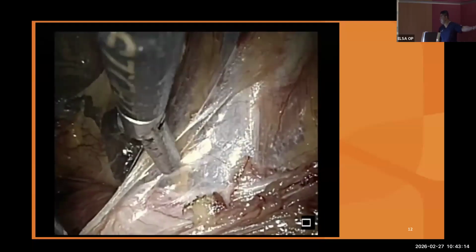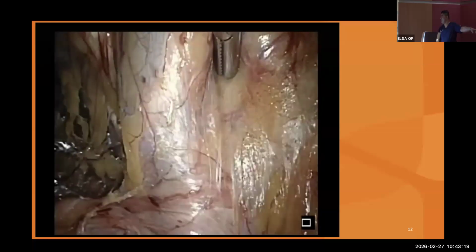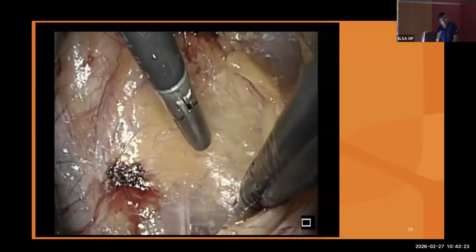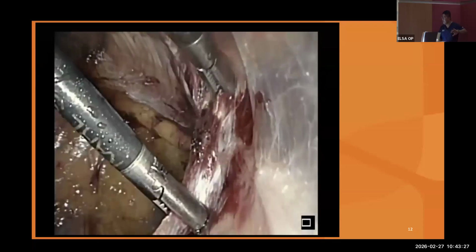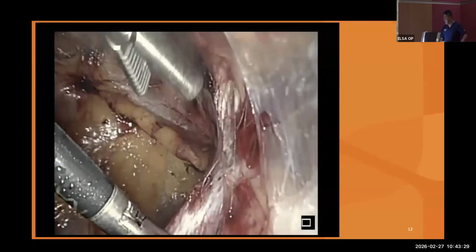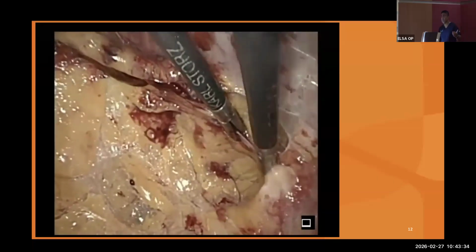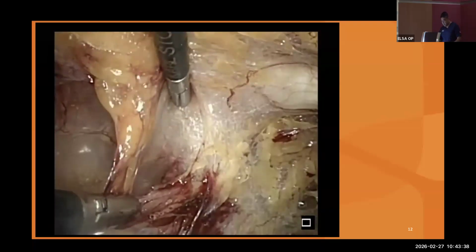So Chris, when you want to use monopolar, that's how you use it instead of bipolar. So that's the layer I was talking about. You see this layer, this moves. So that layer must be there on the nerves. If you take out that layer, then there's a risk of chronic pain, because if you put a foam mesh on there, there's some risk of chronic pain.